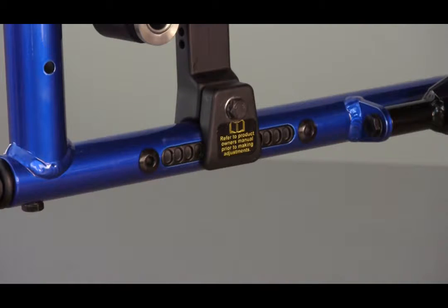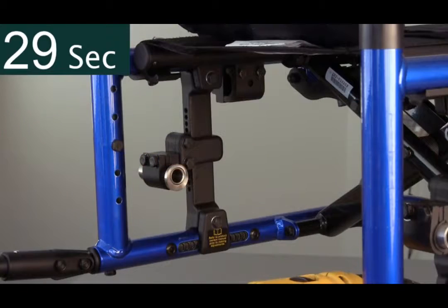In this case, there are four. Each side can be adjusted in under a minute.